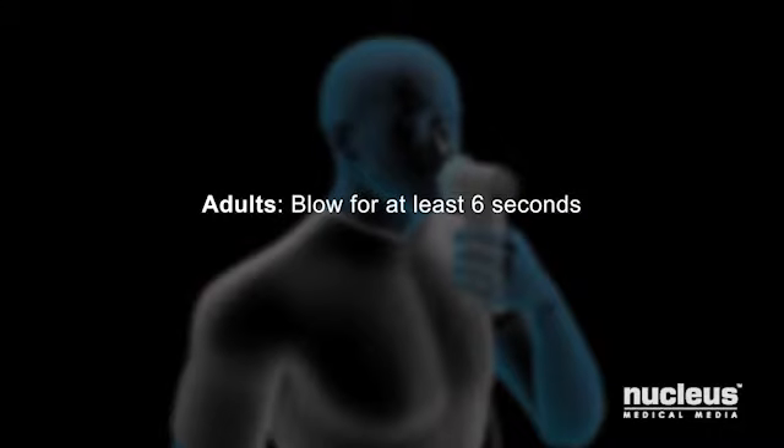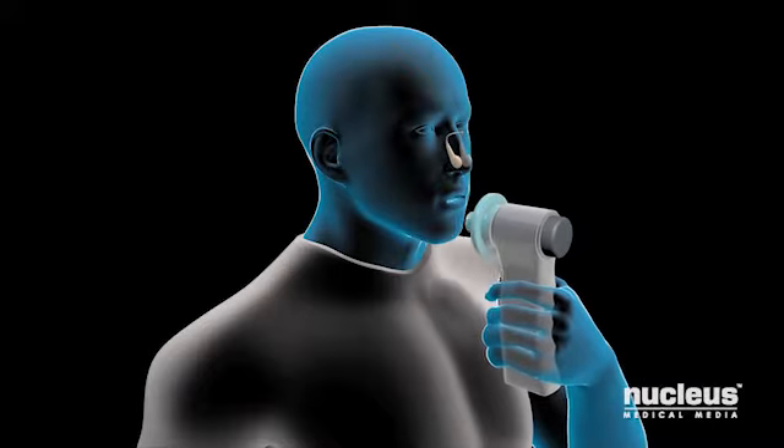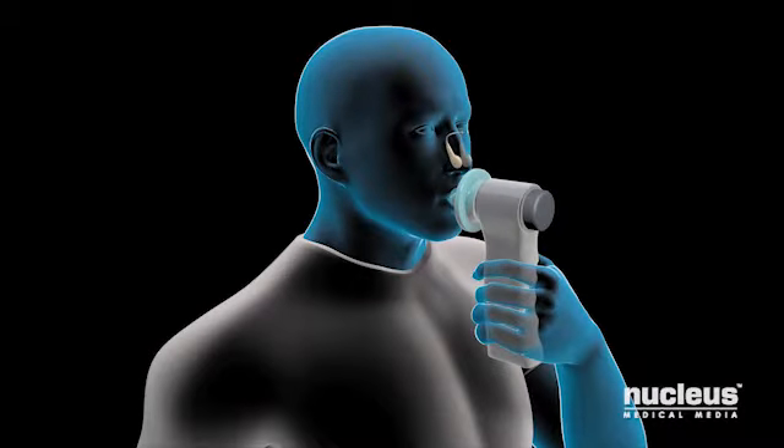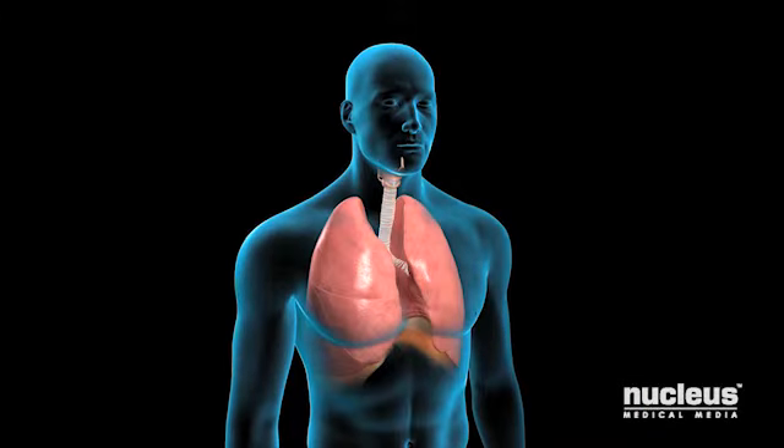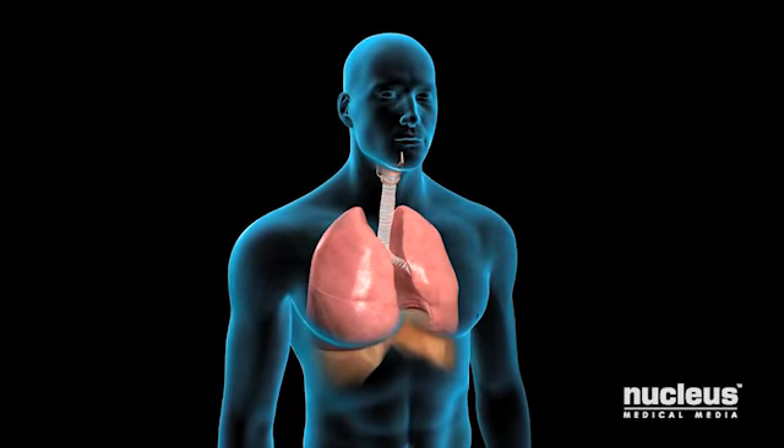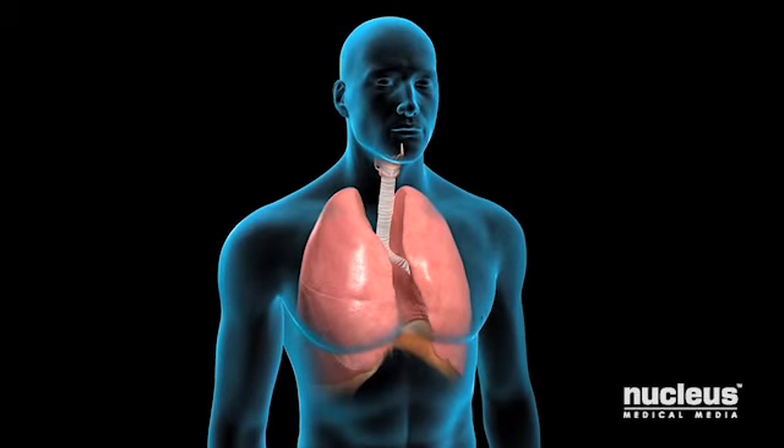Adults typically blow for at least 6 seconds. You will need to perform the spirometry test correctly 3 times to get accurate results. Your doctor will discuss the results with you and let you know if you have any breathing problems.